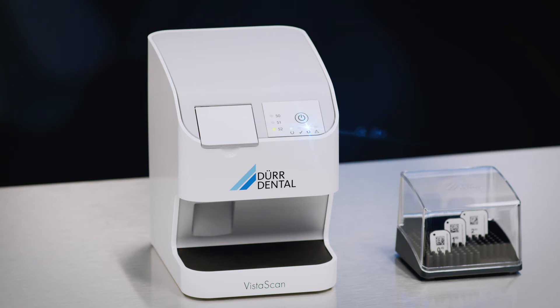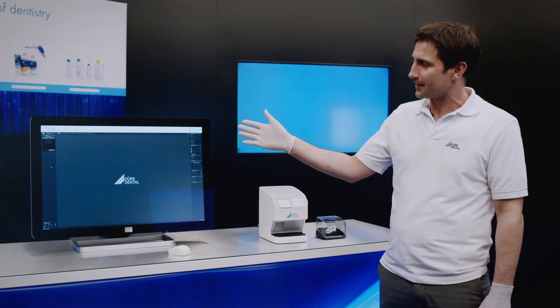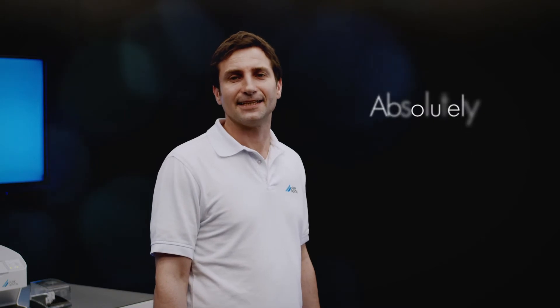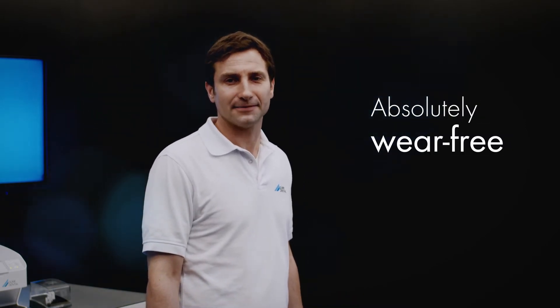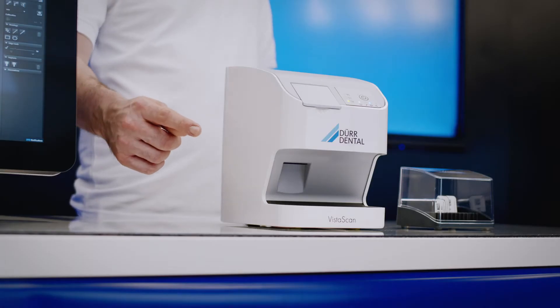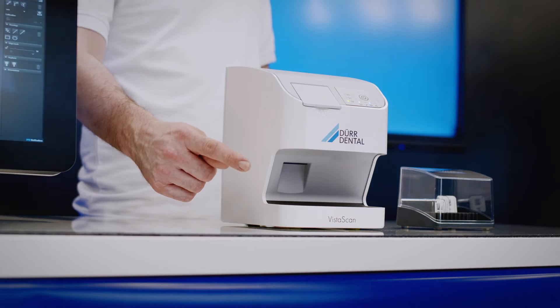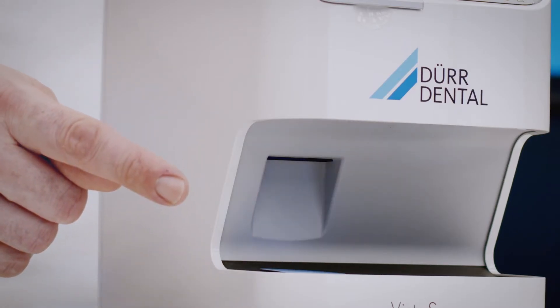During the scan, the control LED on the unit lights up blue. The scanning process itself is completely silent. Scanning progress is displayed in VistaSoft. The scanning unit of VistaScan NanoEasy is fully encapsulated and works with absolutely zero wear. Overall, the unit requires no maintenance by a service technician throughout its entire service life. The image plate is erased automatically at the end of the scanning process, meaning it can be used again immediately for the next patient.